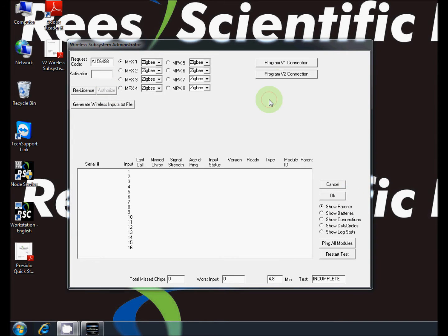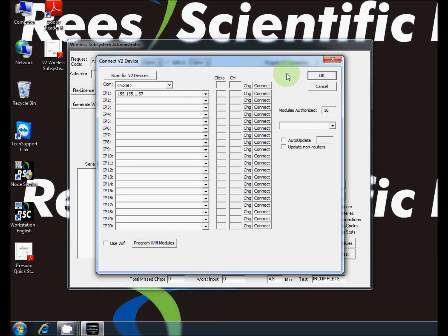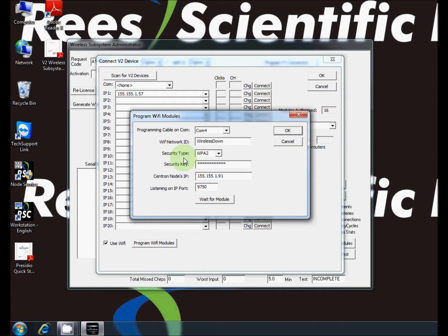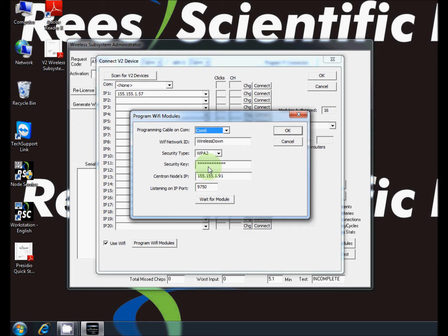Now click program v2 connection and check the box next to use wifi. Now select program wifi modules. Select the correct COM port number from the drop down menu. This information was determined previously using device manager.